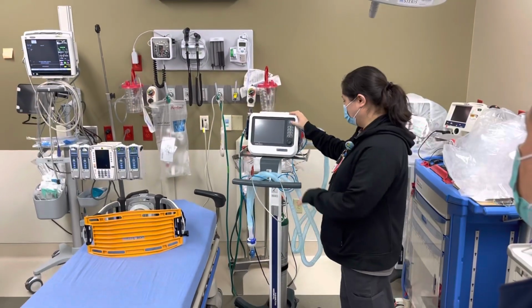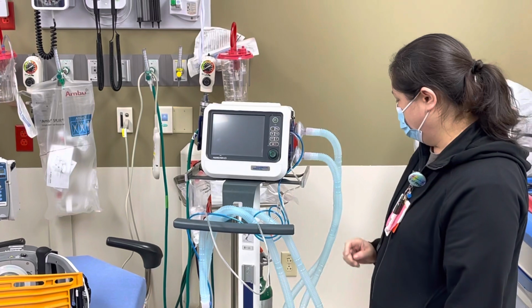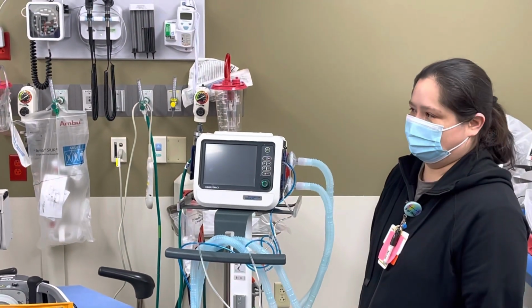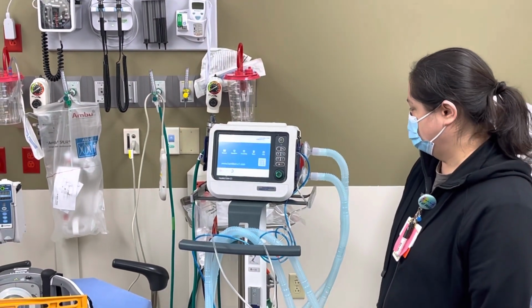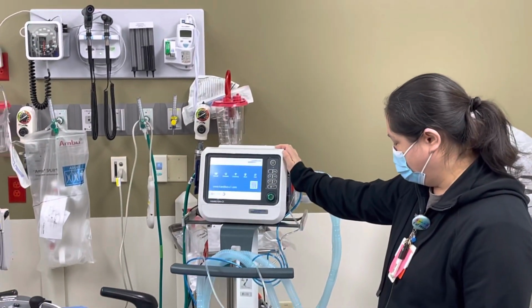through. So you always make sure you hook up to your gas source, make sure you turn it on, always make sure it's plugged in too. So we're just gonna press that power button and give it a minute.